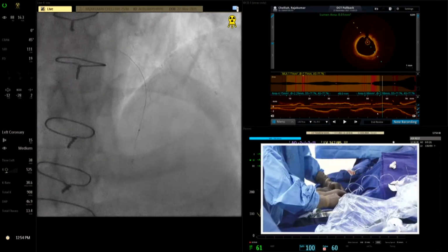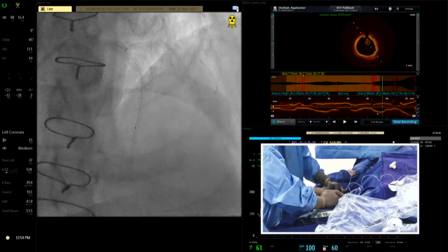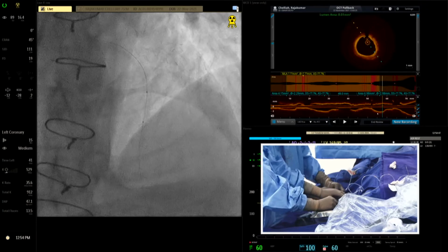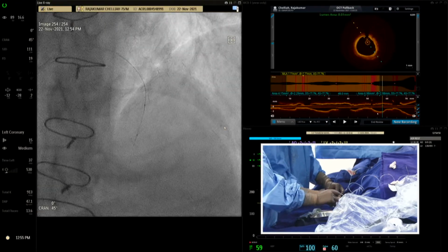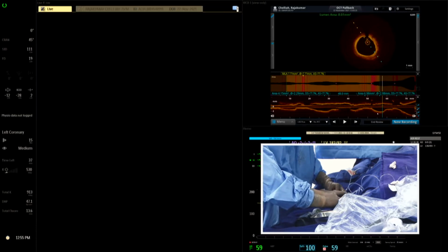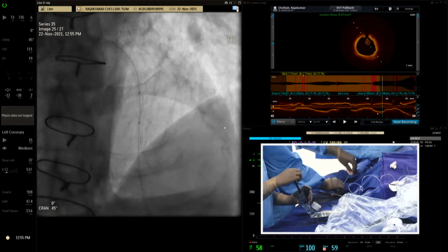Test now. Come back. Test. The test, second door. Test. Yeah, somewhere there. Okay, we'll take a picture and just confirm and then we'll do. Just a place. Yeah. Just a short 2 ml. Yeah, okay, but my guide is out, so that's probably why. Yeah, just go up there then.